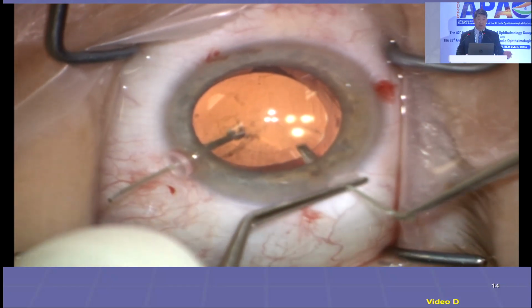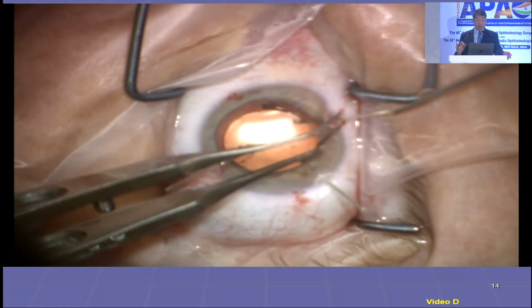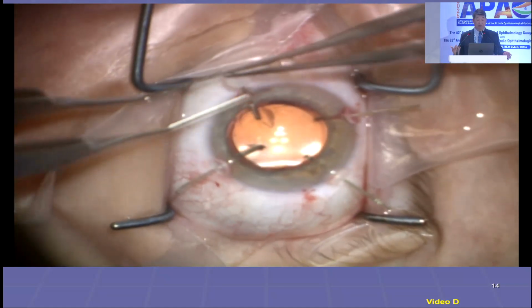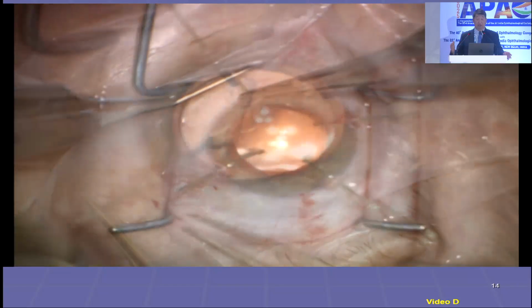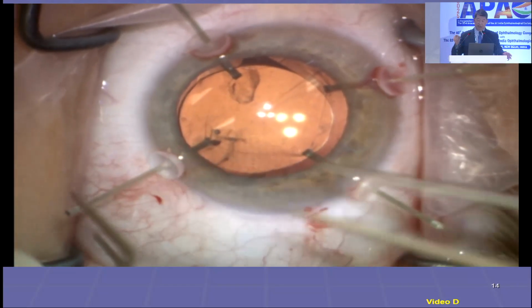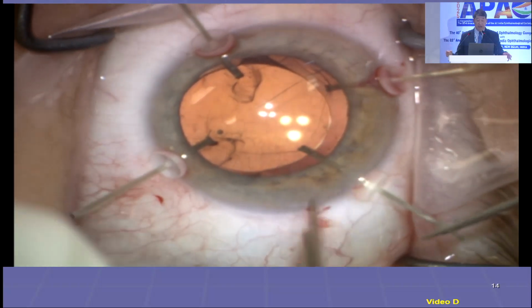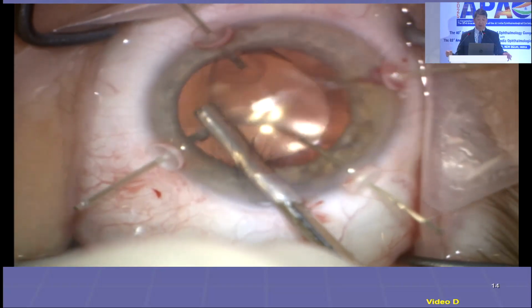These are capsule retractors in the United States. This is from Microsurgical Technologies. They are global. This is actually my modification called the Chang. I have no financial interest. It's just a double-stranded nylon loop. We made the tip closed so the CTR won't go inside. And now see what happens.